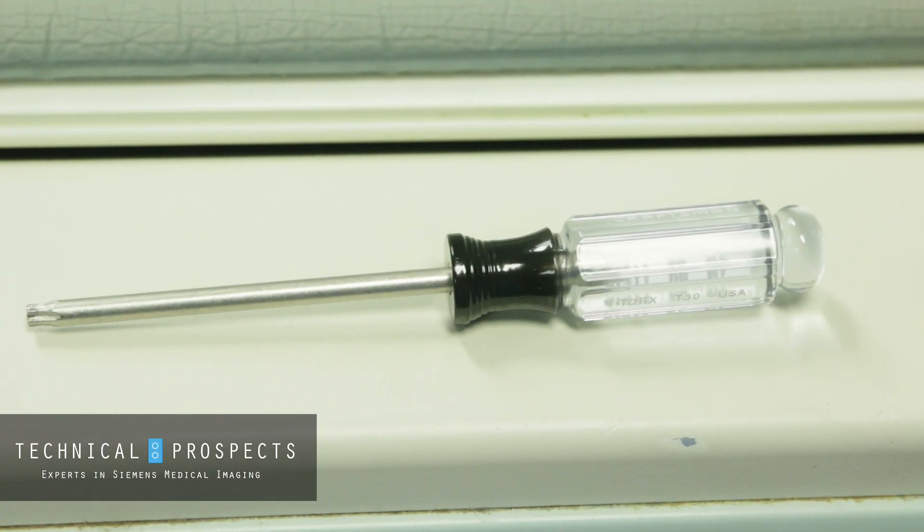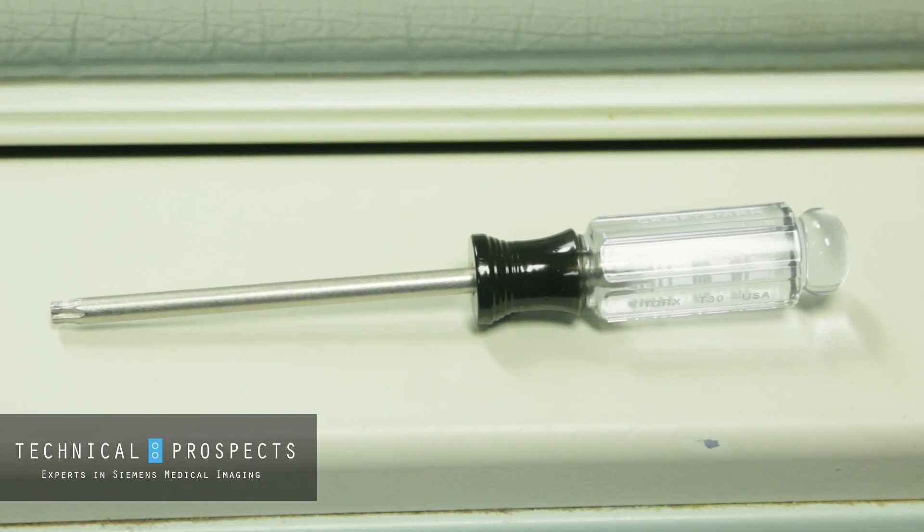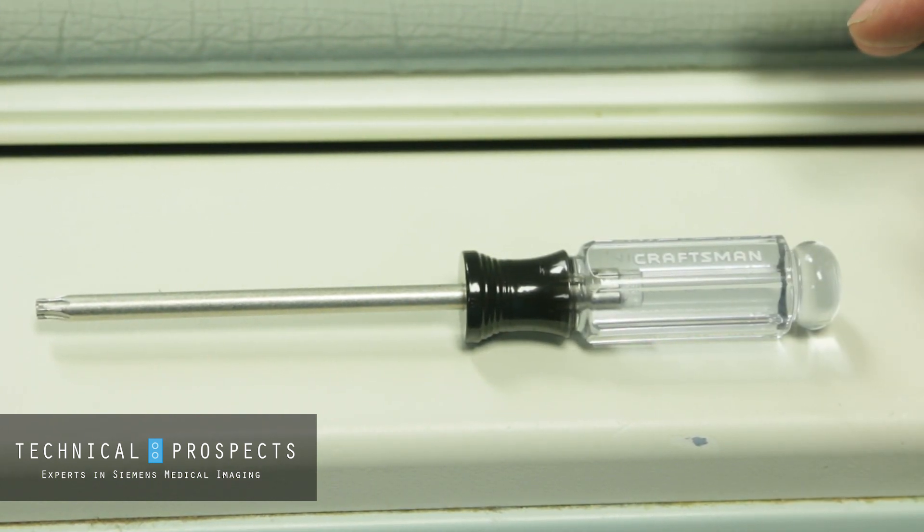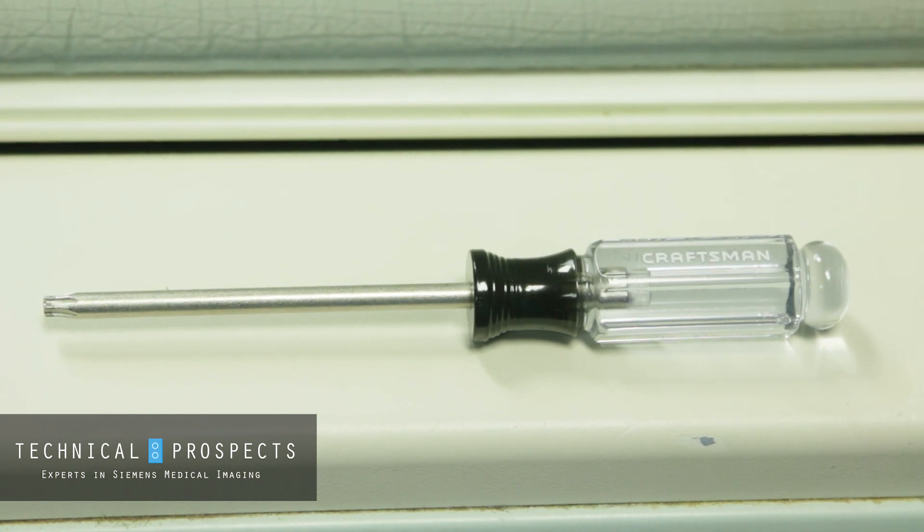A really important tool when you're working on a Definition system is that most of the cover screws are going to be a T30 Torx. A lot of the screws on the system are Torx, and in this case for cover screws the T30 is the size you'll need.